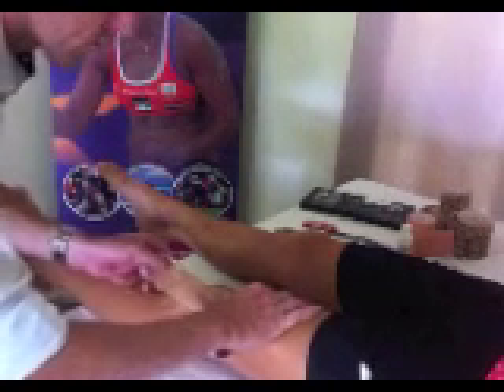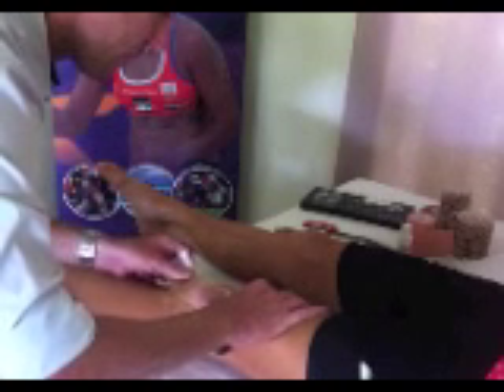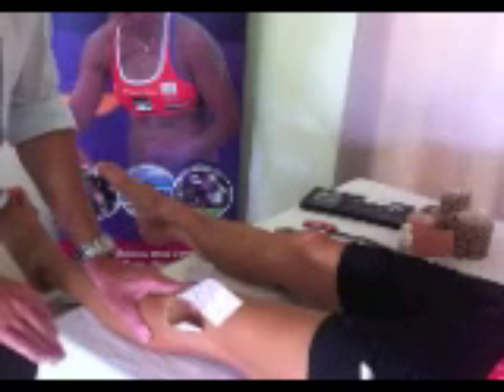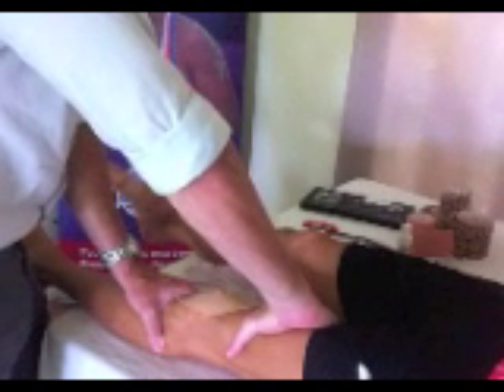Hold that anchor for a few seconds first to get the glue bonding. Then place a medial glide on the patella — you don't need a great deal of stretch as there is much more resistance with these power bands. Place your stretch on gently and leave a nice anchor point at the bottom with no stretch on it. Hold that for a few seconds, then come to the top end and do the same thing: place your medial glide, maintain it — easiest with the thumb of the bottom hand — then swoop your fingers around to smooth it down running medially, with the last couple of inches without any tension. Give the ends a nice hold to get the glue bonding well.